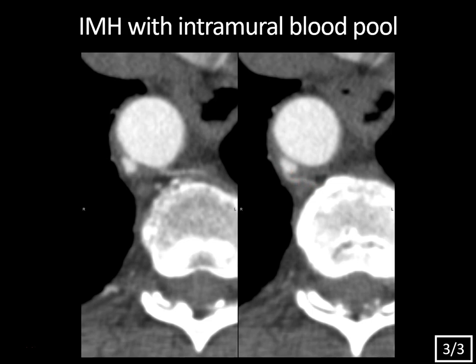Also, you don't really have a communication with the lumen. Remember, the ulcer-like projection has a wide communication with the lumen. In this case, you do see this little pinpoint tiny orifice, which you could sometimes see, but usually that won't be any wider than the actual feeding artery going to this intramural blood pool. These tend to just resolve over time, so they have no poor prognosis. It's just an incidental finding, but you don't want to confuse them with an ulcer-like projection.